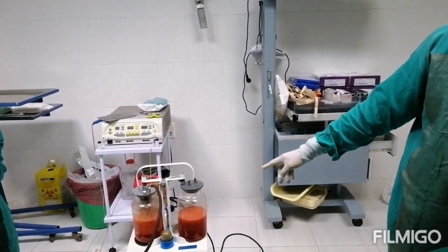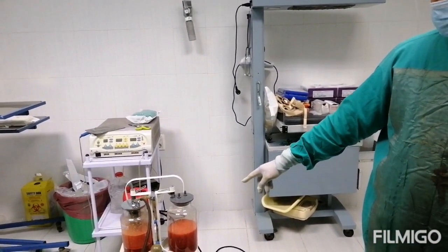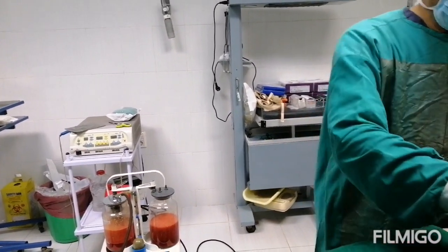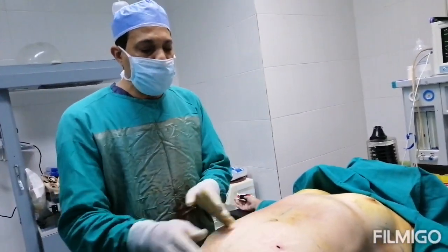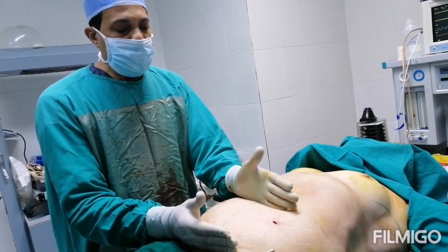This is the liposuction fat which is coming out from this procedure. We are going to finish this stage. Now we move to the stage of the tummy tuck, where we will make the incision here. These two liposuction incisions will be removed because all of this area will be taken out in the tummy tuck.